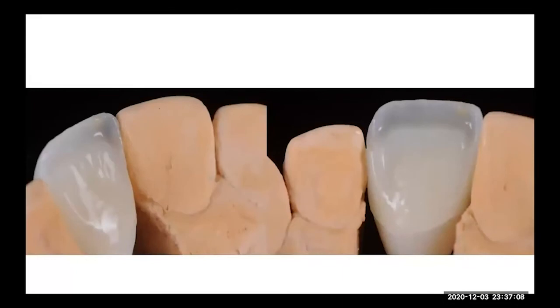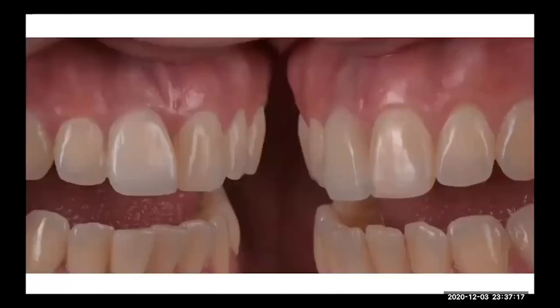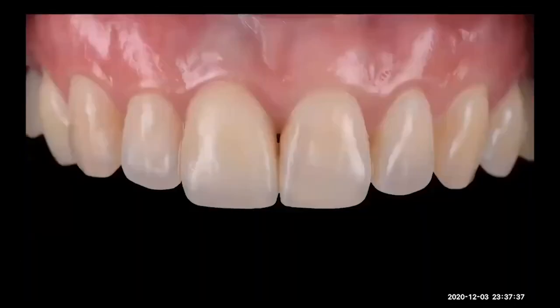zirconia abutment. You see some different colors in the scoop portion. Then we follow all the things with our enamels. And this is the try-in of the crown. You see, it's a little bit light. So in that way, we confirm that the picture he took was wrong, because sometimes the colors get down in color, in chroma, half a shade or one shade. So we need to be careful with that when we take colors. So this is our final crown later on.